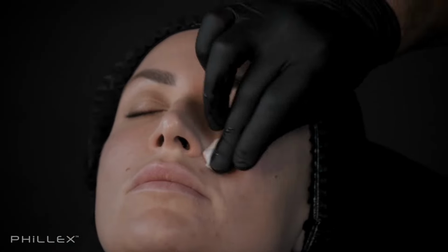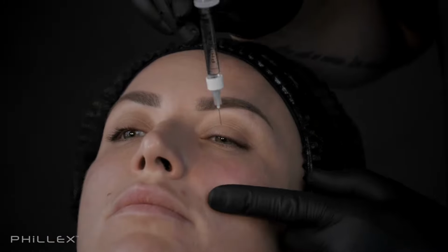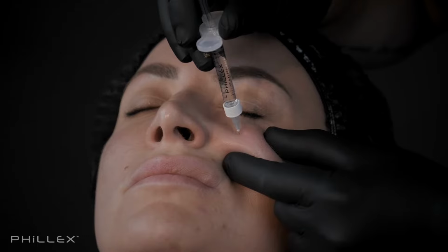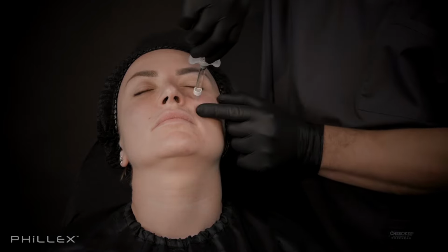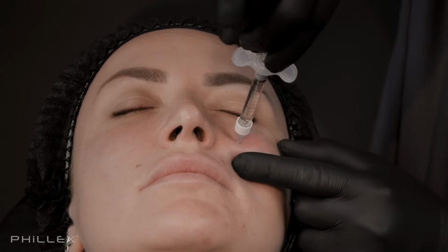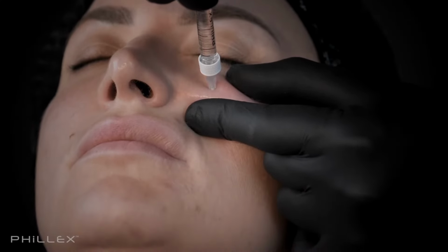The idea of the first injection is the restoring of the volume of the medial part of the middle third. So we are asking our patient when she feels pain, or whether here is the place that is dangerous, so we will inject a little bit more lateral. We are injecting very deeply to the bone because our injection is supraperiosteal. And we are starting to make our aspiration probe. It was more than 10 seconds. And we are starting to inject.